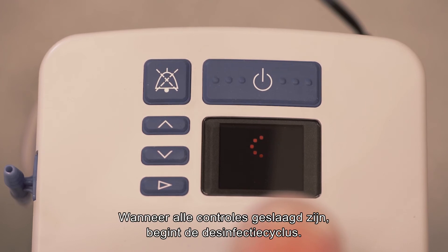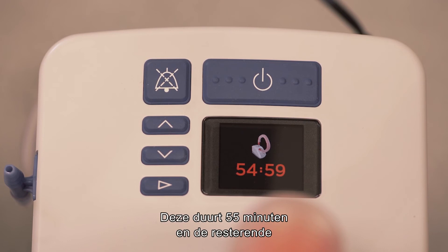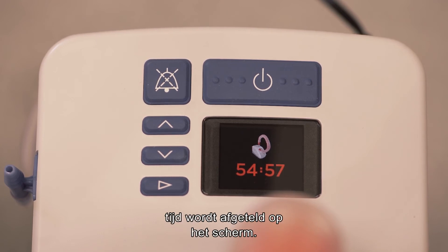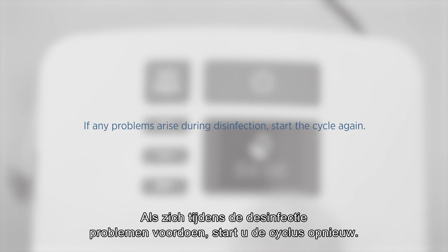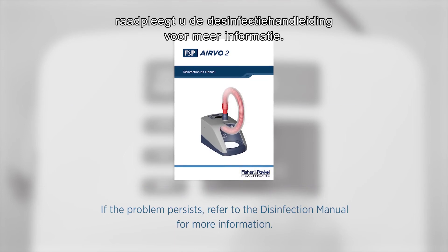Once everything checks out, the disinfection cycle will begin. It will take 55 minutes to complete and the display will count down the time remaining. If any problems arise during disinfection, start the cycle again. If the problem persists, refer to the disinfection manual for more information.